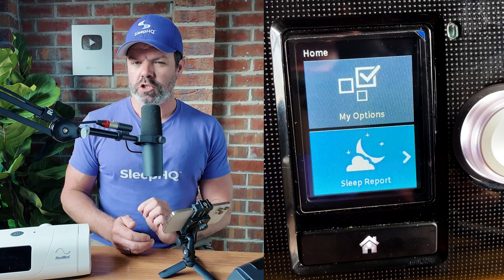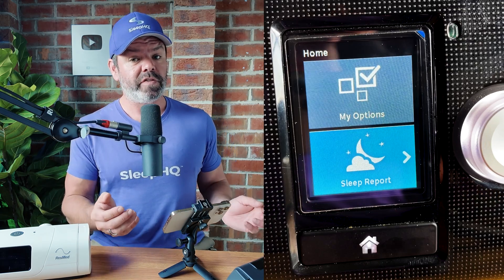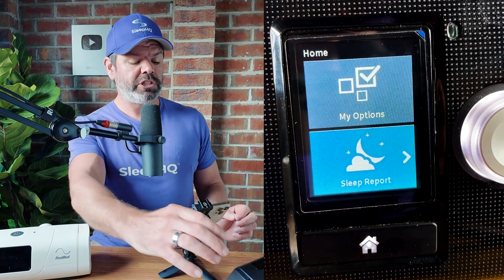G'day mates, hope you're having a ripper day. Today I'm going to show you how you can access 80% more CPAP therapy data directly on your CPAP machine by changing one little setting. It'll take you 30 seconds. We'll start with the AirSense 10, and straight out of the box with factory settings, the sleep report is very basic — not much information at all.